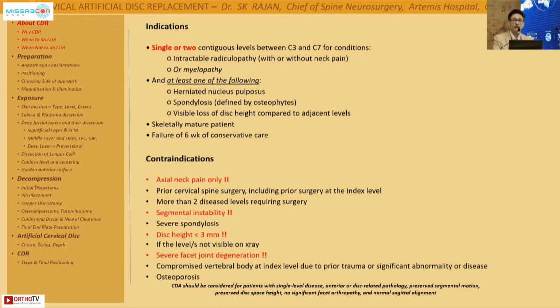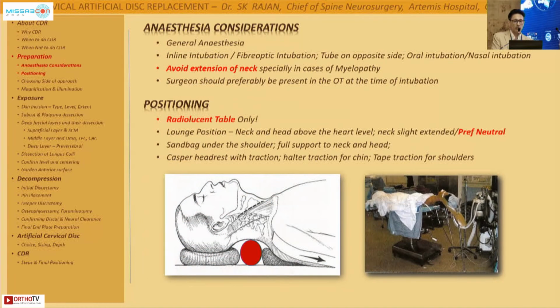Similarly, if the disc height is really low, and that means it's practically degenerated, we should not consider cervical disc replacement for such patients. Also if there is severe facet degeneration, if you can't see the joint line, there's no point going for a cervical disc replacement in these cases. Another contraindication is that you should be able to see the involved disc space on a lateral X-ray.